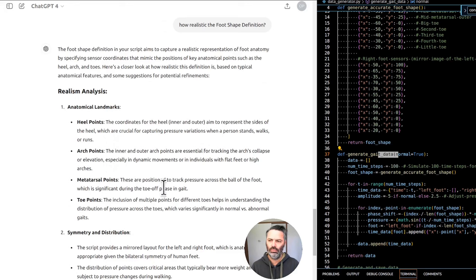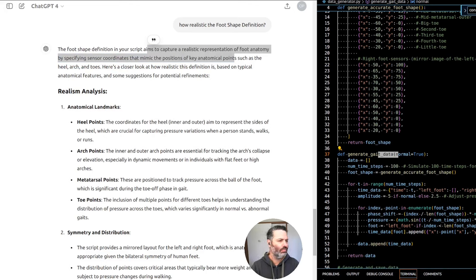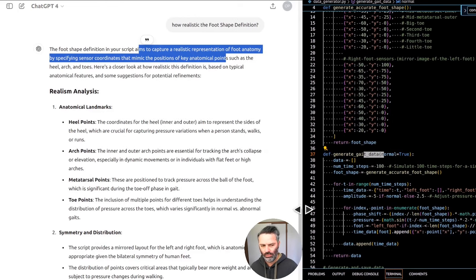The foot shape definition in your script aims to capture a realistic representation of foot anatomy by specifying sensor coordinates that mimic the positions of key anatomical points, such as the heel, arch, and toes. Here's a closer look at how realistic this definition is, based on typical anatomical features, and some suggestions for potential refinements. Realism analysis. 1. Anatomical landmarks. Heel points. The coordinates for the heel, inner and outer, aim to represent the sides of the heel, which are crucial for capturing pressure variations when a person stands, walks, or runs.